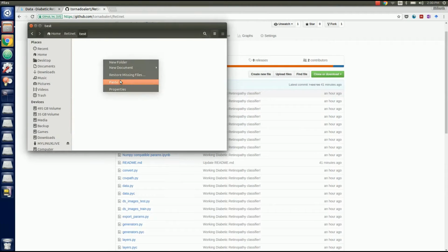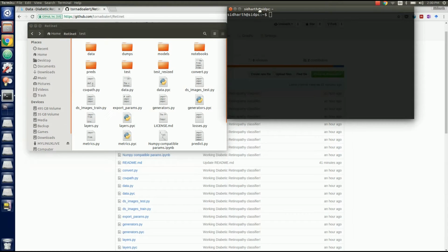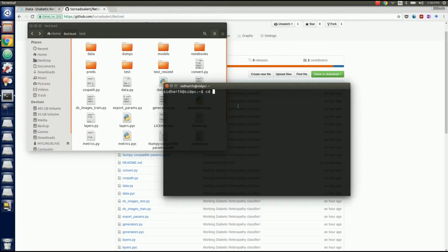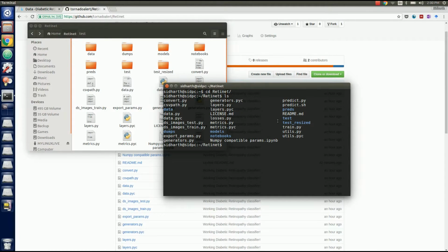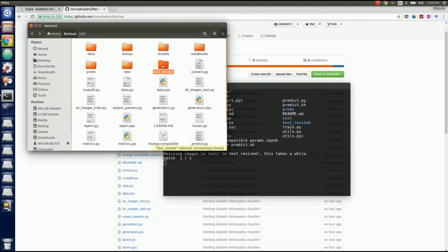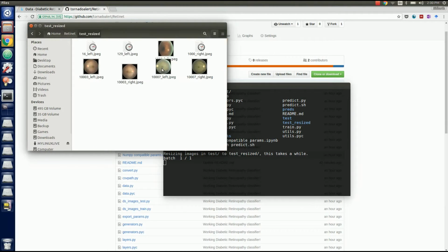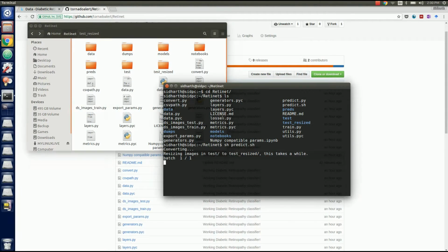into the test directory. After doing that, open a terminal and then change your directory to Retinet. And then I have a script called predict.sh. So just run that script. It'll do all that's necessary. So what this does is it first converts the images in test into a resized image that is smaller, because the neural net can only handle 512 by 512 images. So it's converting right now.